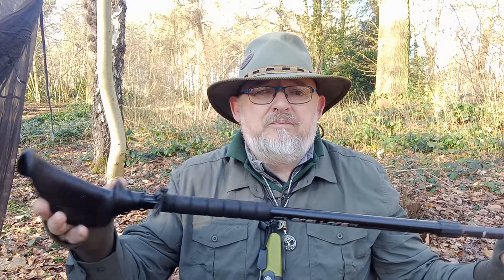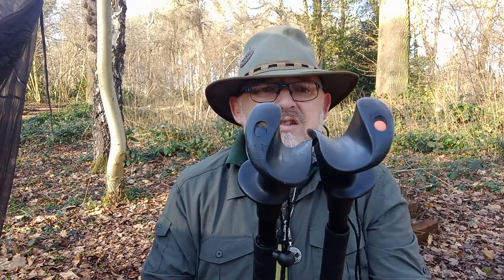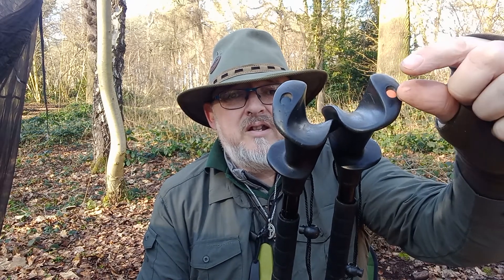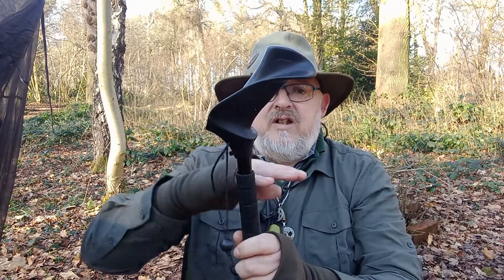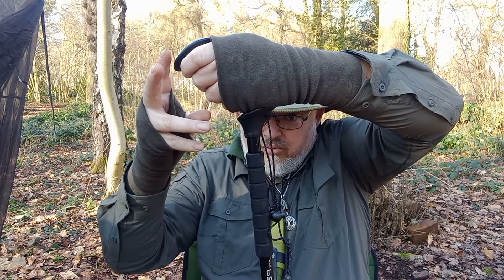I have spare feet and sand baskets in a little mesh bag. There's a right and left, and at the end there's a little colored dot so you know which is right-handed and left-handed. Incidentally, you can take the tips out and put a threaded insert in there to attach a camera mount or fan camera mount. I also have neoprene over-gloves that fit over the handles — a bit like a gauntlet used on motorbike handles — and your hand is completely engulfed in neoprene.